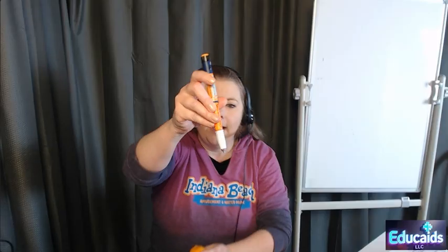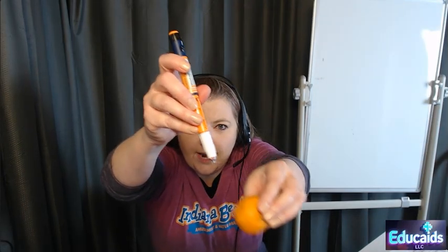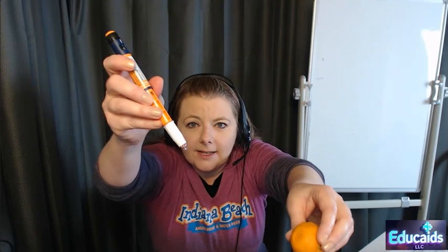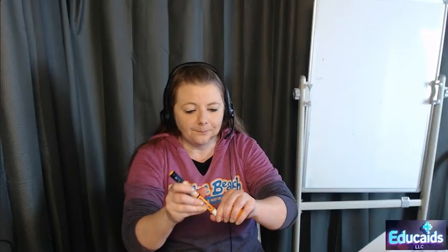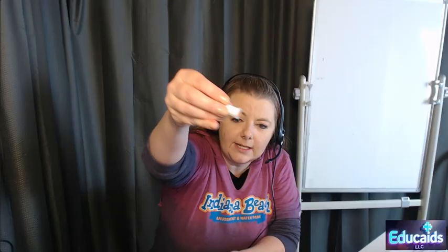And then you lift it up. And then I want you to see that the safety is engaged. Once it retracts once, it will not retract again. So if you went to administer your insulin and accidentally engaged the safety before you administered it, you have to get another needle, okay? Because that will only retract one time. And now you can see that there is a safety piece over that, because now it's a used needle. So now you can't hurt yourself, all right? So then we would put our cap back on and go put this in the patient's drawer.